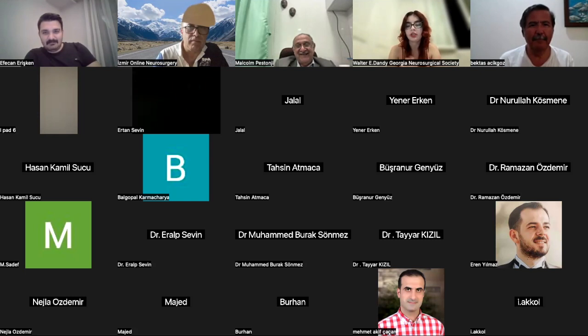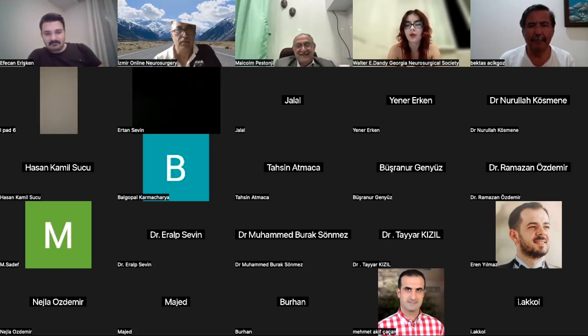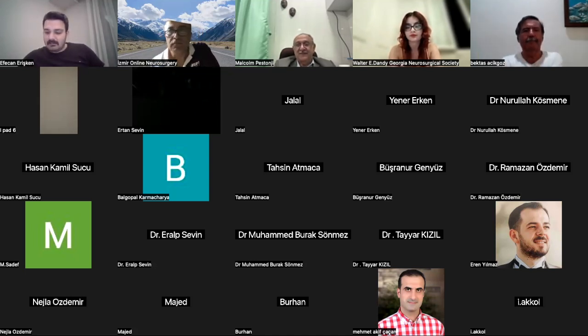Yes, so now we will move to the questions in the chat. Maybe Efe, you have a question to start with? Yeah, I have a question, sir. Thank you for the informative and didactic lesson, as always. And I want to ask, it's stated that UB is contraindicated in infections, uncontrolled infections and tumors. Have you used it in these cases?